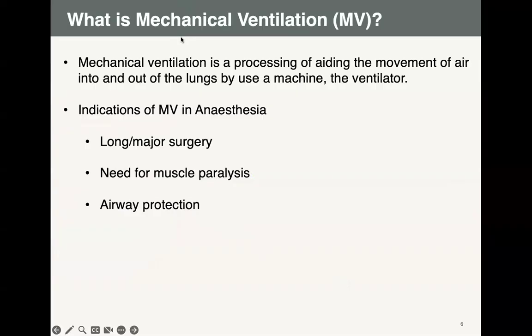So mechanical ventilation is simply when you are adding to the movement of air in and out of the lungs by using a machine. Ventilation is that movement of air, and mechanical because you are using an extra thing to do it, which is a machine, a ventilator in this case, and that's why it's called mechanical.